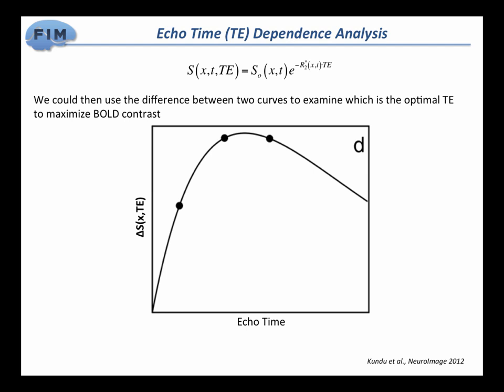When you go down to the scanner and you do your single echo fMRI, you usually set up, as one of the many parameters, your flip angle, your voxel size, TR. Another one is the echo time, and that is usually chosen looking at curves like this, and the theory tells you that in general, the echo time that you should select should be equal to the T2* of the tissue of interest, and that's because that's how you see it at the top of this curve.